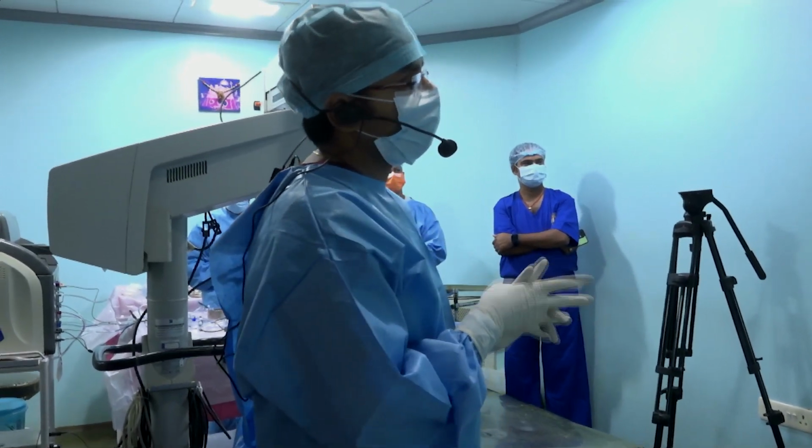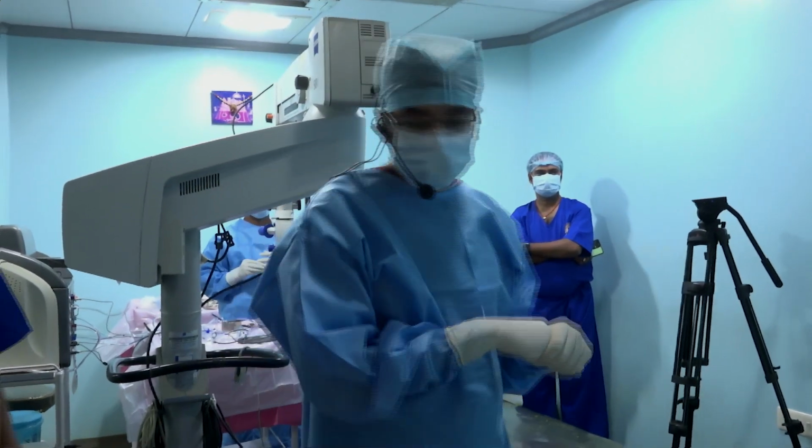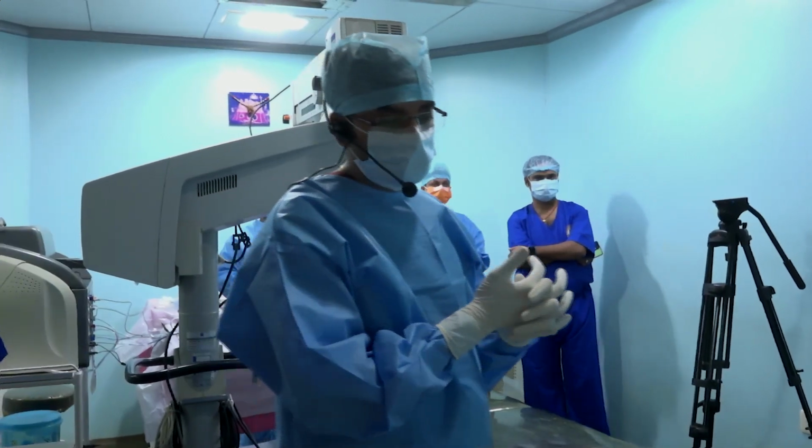Okay. I think Deepak sir wants to add. For a belt buckle, it's very important that we do a good B-scan preoperatively. Anything anterior to the muscle insertion, any traction, it's better to put a buckle. So the B-scan plays a very important role. It's important that we preoperatively look for any peripheral traction going anterior to the muscle insertion. If it's there, it's better to put a belt buckle because it's very difficult in vasculitis cases to pull the traction.